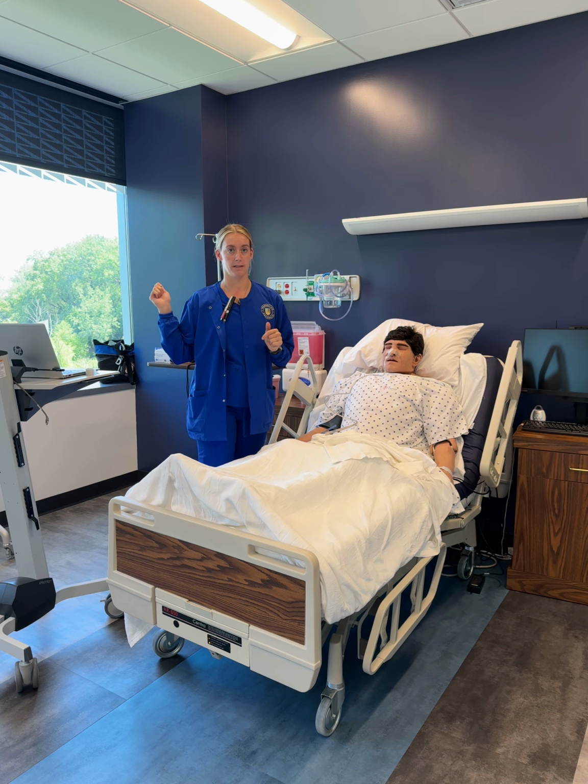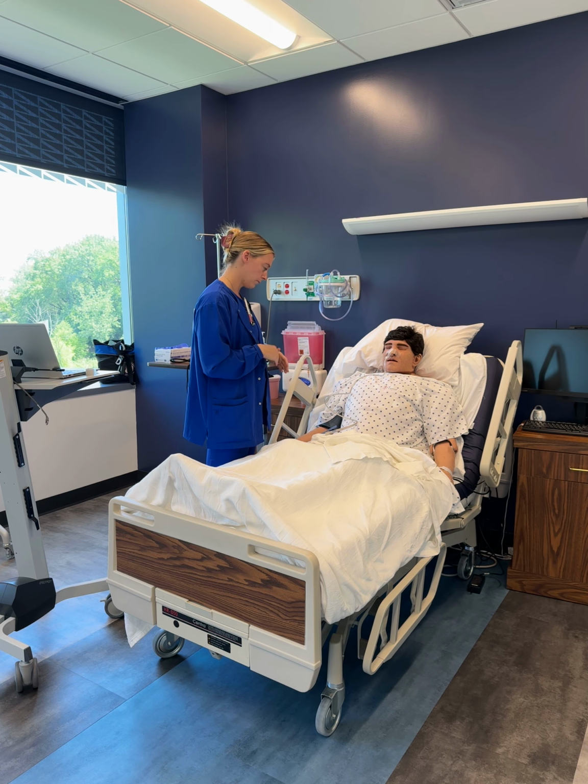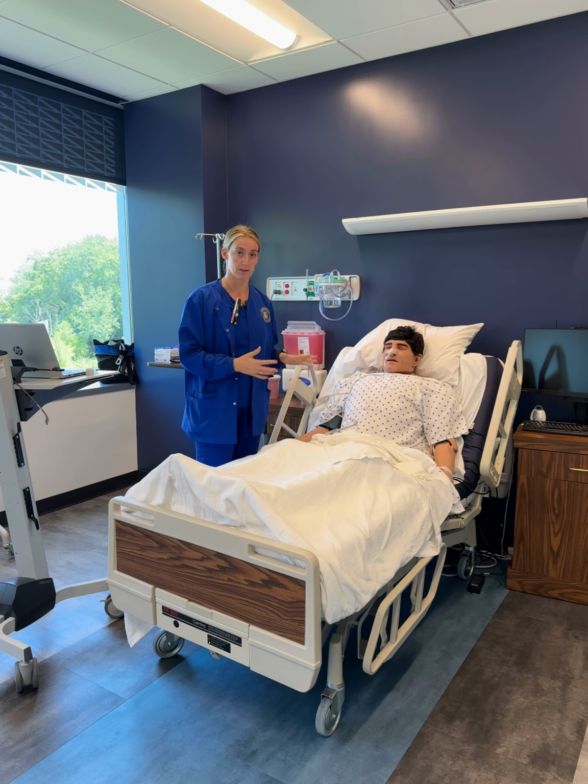I'm going to provide privacy, and then I'm going to educate the patient again on removal. We're removing it because your bowel obstruction has resolved. Do you have any questions? You may have discomfort and gagging due to the removal of the NG tube. If it gets to the point where it's just unbearable, please do not communicate because it could disrupt it. Just tap my hand or put your thumb up or just do some type of movement with your hands. I'm then going to ask if the patient has any goals due to the outcome and get verbal consent.